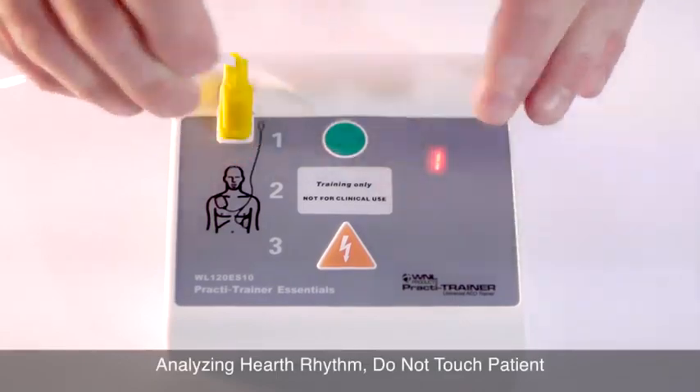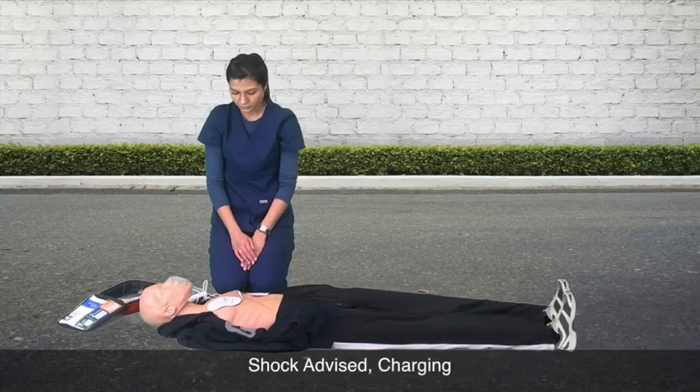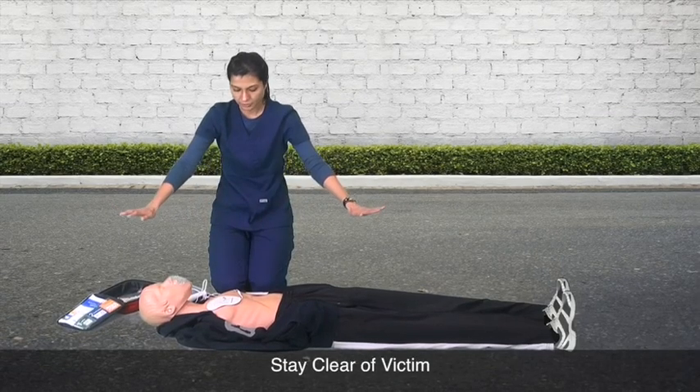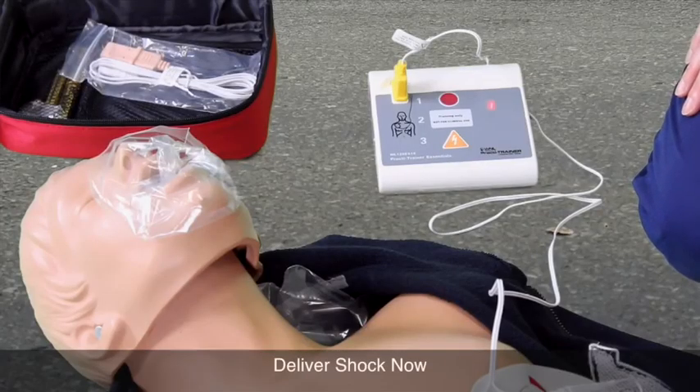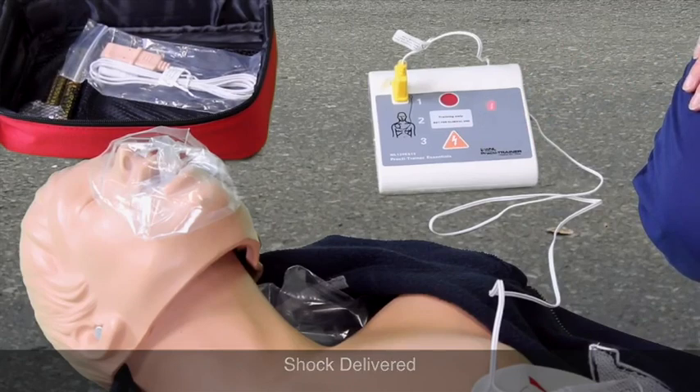Analyzing heart rhythm. Do not touch the patient. Shock advised. Charging. Stay clear of patient. All clear. Deliver shock now. Shock delivered. Begin CPR.